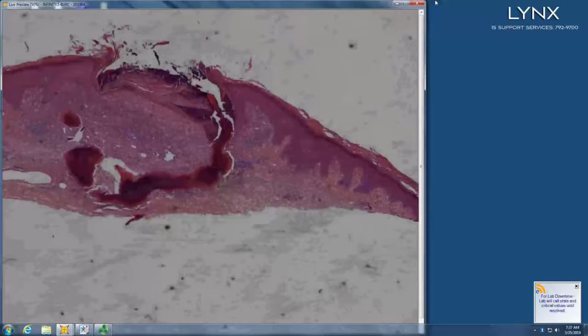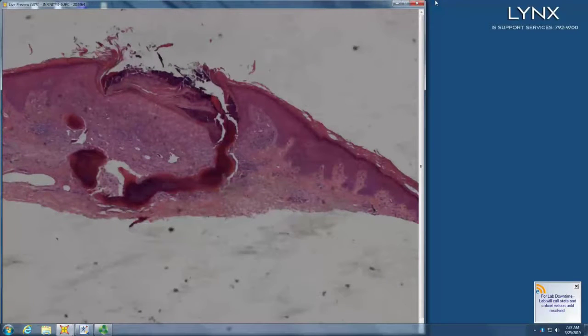There we go. So something perforating, and what is perforating? Osteoma cutis. And when there are multiple like that, spitting out through follicles, it's usually post-acne, right? So you've got like birdshot all through your face after acne.